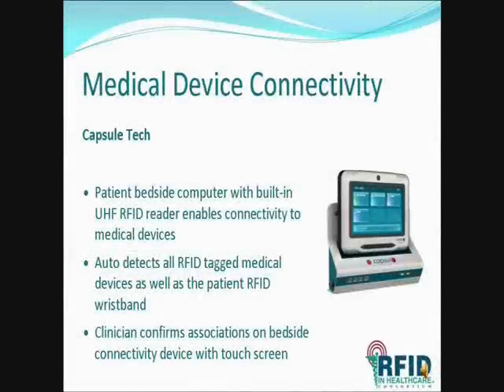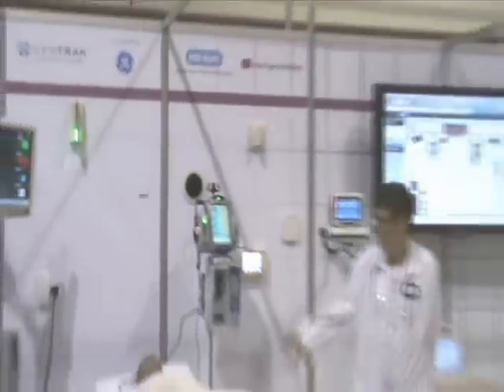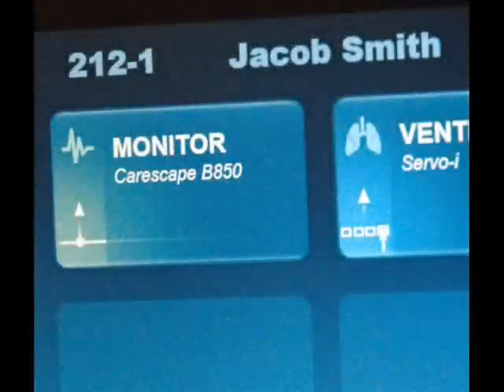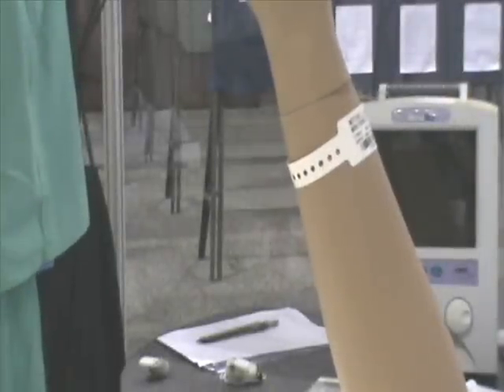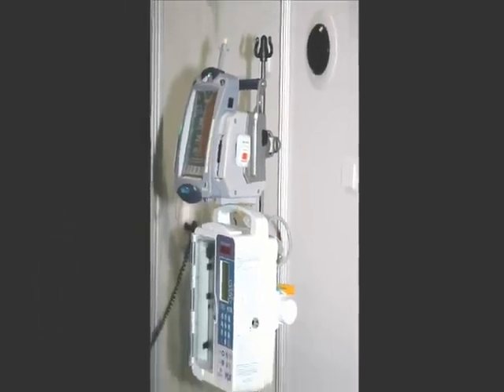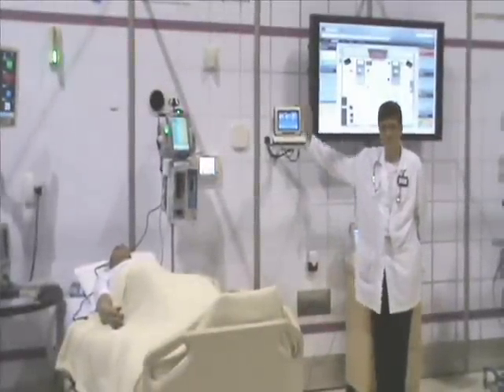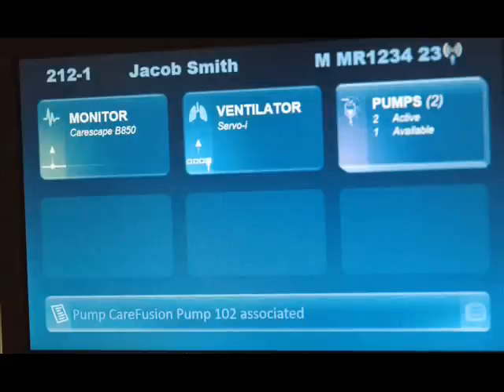In order to communicate medical device data with other applications, there needs to be a confirmed association of the devices to the correct patient. The first step is for the patient to be positively identified through the patient RFID wristband. The patient bedside computer has an RFID reader that automatically detects the presence of the patient and the presence of the medical devices equipped with RFID tags. On the screen, I can confirm that this is the correct patient, Jacob Smith, and that each of the medical devices are now associated to the patient.